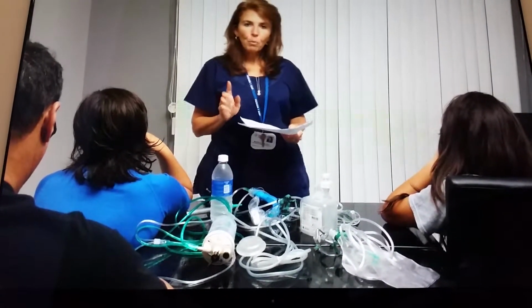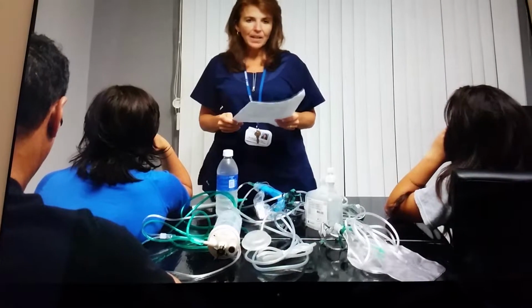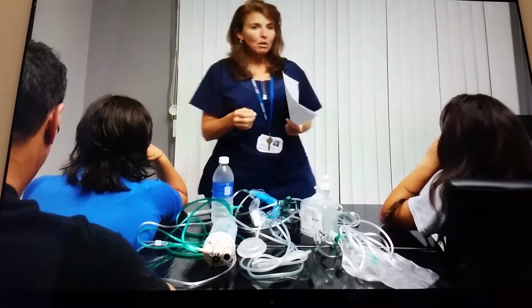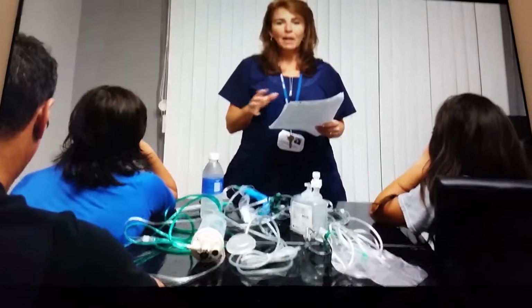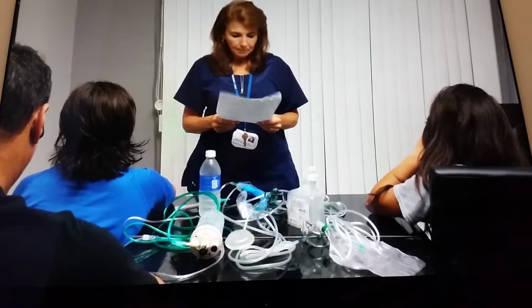And one of the other things that I had, there's a good safety tip from the American Lung Association, and that's actually no Vaseline products, anything petroleum based, because they are also combustible. So therefore, you do not want to have your patients using those types of products. If anything, it should be water-based.